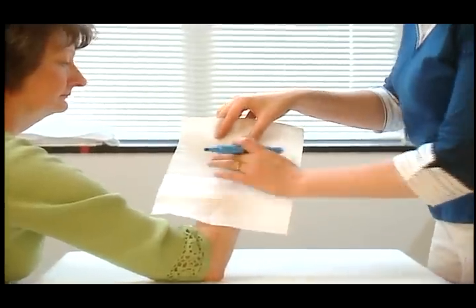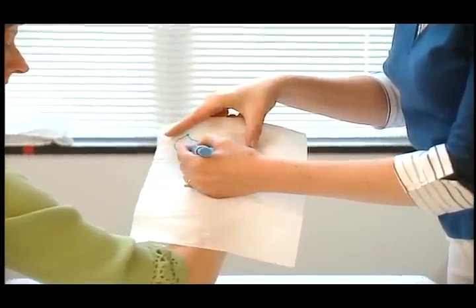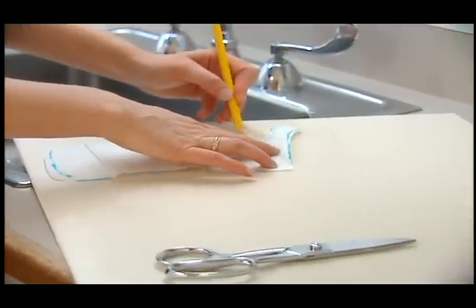Once you have decided on the appropriate splint design and material to be used, you are ready to make a splint pattern. Using a paper towel, you can create a moldable pattern by placing the patient's hand on the paper and marking the anatomical landmarks according to the design being used. Transfer the pattern to the splinting material by tracing it onto the plastic with a wax pencil or an awl.